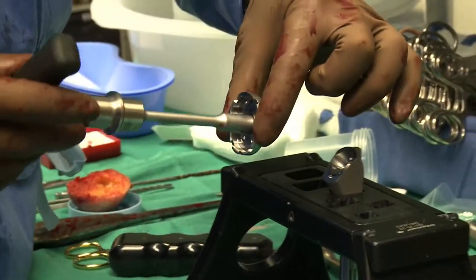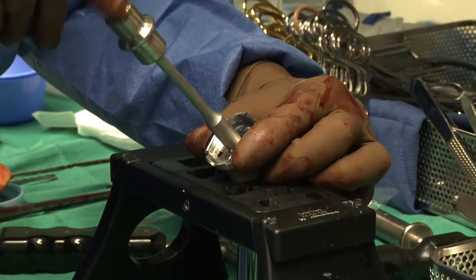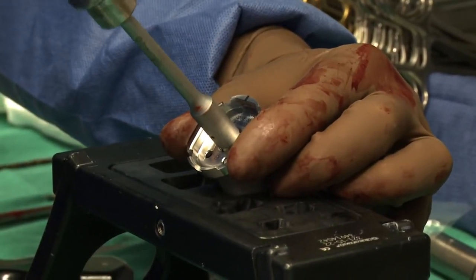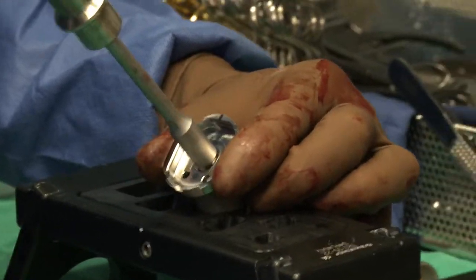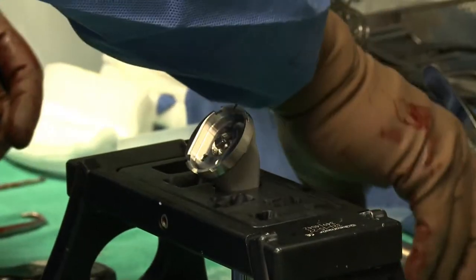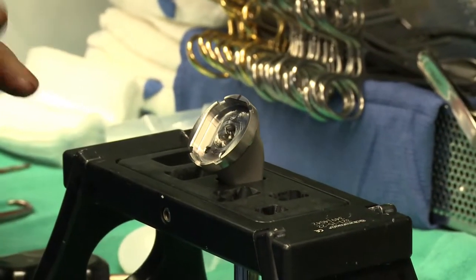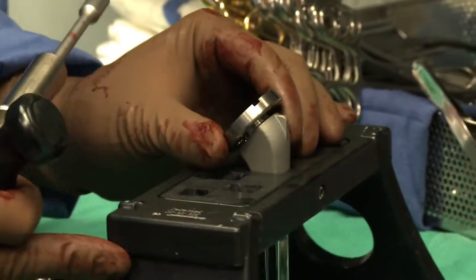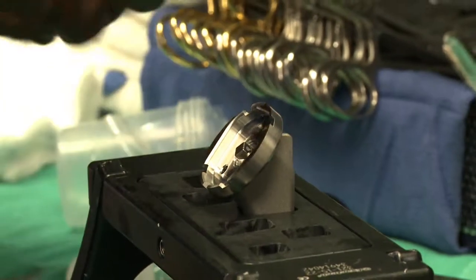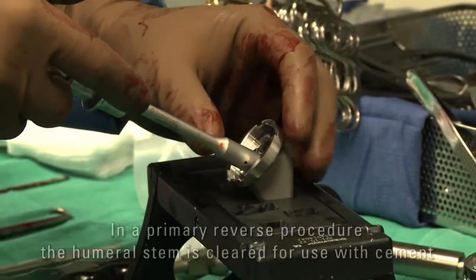This system allows for in situ or back table assembly. The implant is inserted into the corresponding stem size on the back table stand. The humeral tray with the reverse torque screw is inserted into the stem with the laser line lined up to the lateral fin. Tighten the reverse torque screw by hand. Then apply 11 newton meters of force to break off the screw and engage the Morse taper.